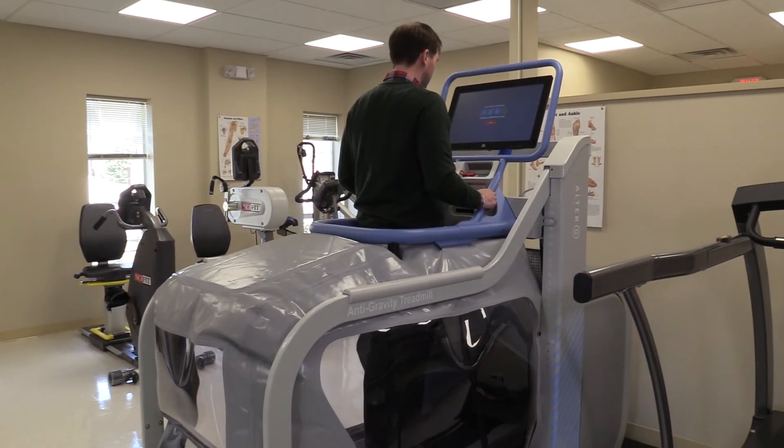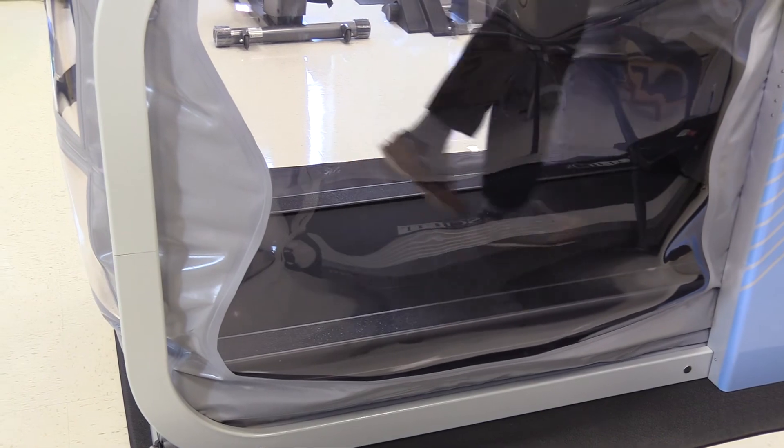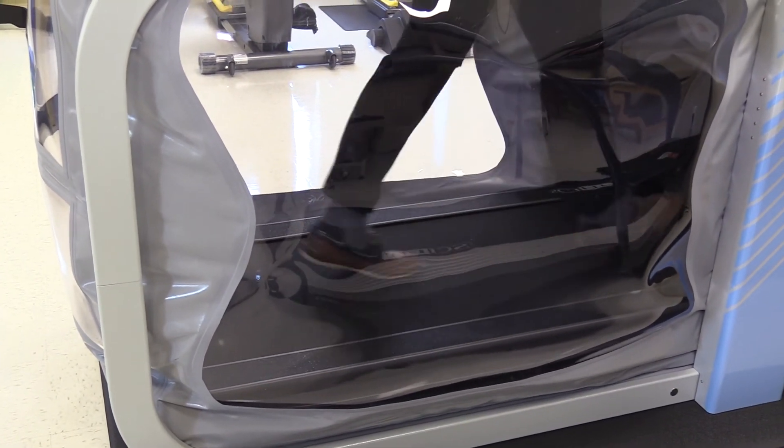You initially start at a hundred percent of your body weight. With each successive progression down to a lower percentage, you can feel that you're becoming lighter. We can go down as far as 20 percent body weight — walking on the moon is about 18 percent of Earth's gravity, so we're pretty close. It feels a little strange, but it's pretty remarkable.